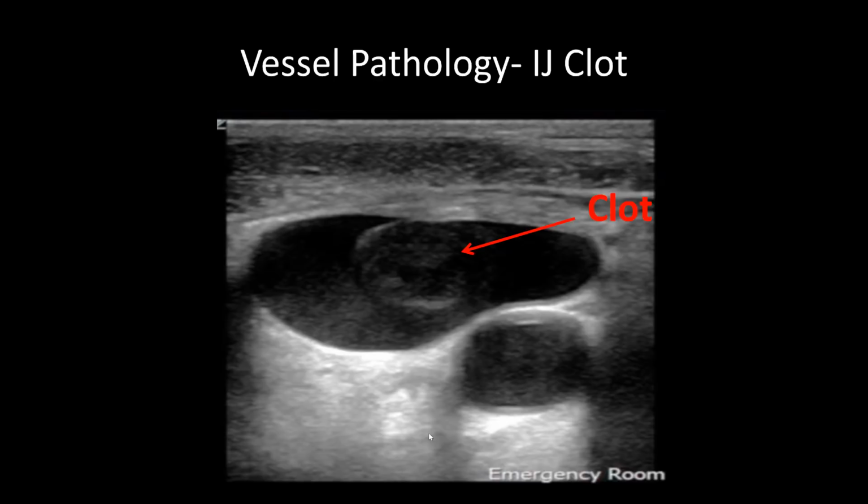Things we are looking for primarily are clot. Clots can be hyperechoic, hypoechoic, or anechoic. Thus, it is important not just to sweep the vessel, but to also compress the vessel.